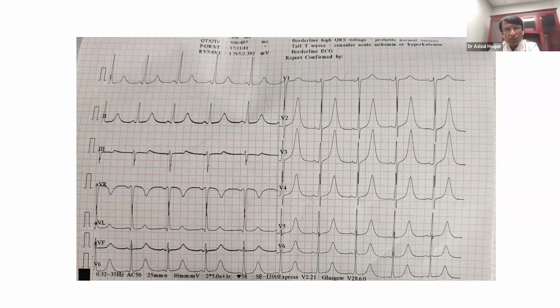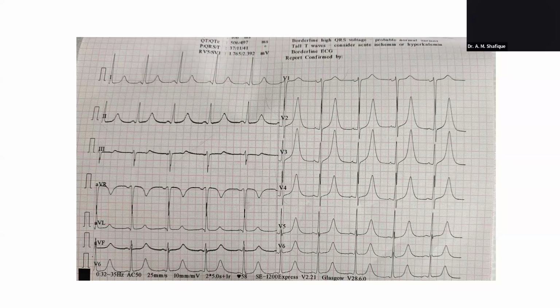Sometimes we see this type of change when they're a little bit tachycardic, but the patient is not tachycardic. Actually, this really embarrassed me. I could not fit the ECG in any way. But I was totally curious whether the patient had ST elevation. In the meantime, I was following the patient and getting the ECG by WhatsApp, and there is no ST elevation there.